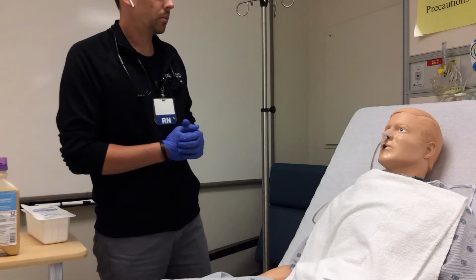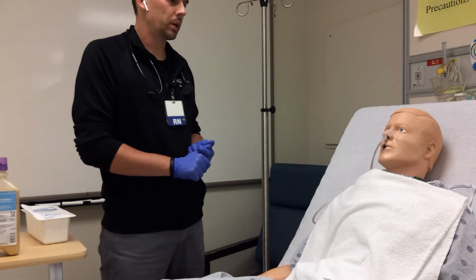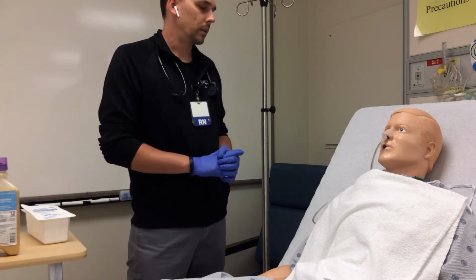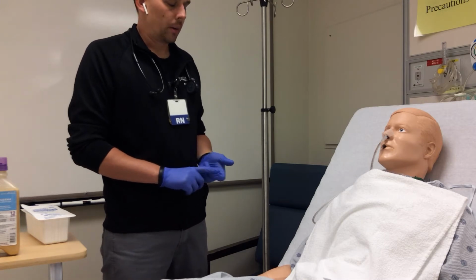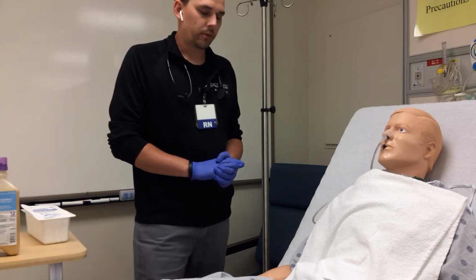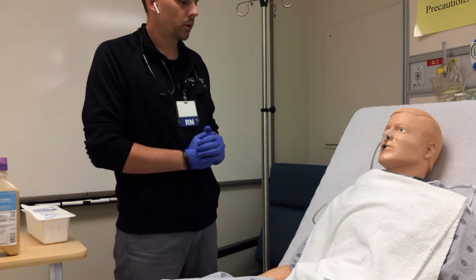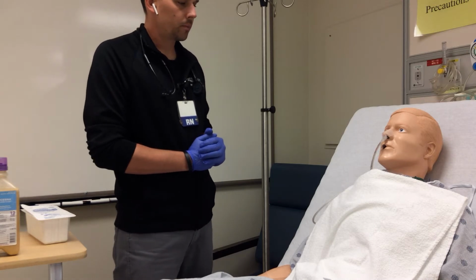So first thing we want to do prior to entering a room, again, we are reviewing our physician's orders, making sure we know the correct rate, have the correct formula, and are following physician orders for the continuous tube feed. We also want to verify patient allergies. We want to verify the patient's weight, review their lab results, check their vital signs, and then we are going to complete that focused nasogastric tube assessment. For time purposes, I'll have you guys refer to the nasogastric tube assessment video for further information there.